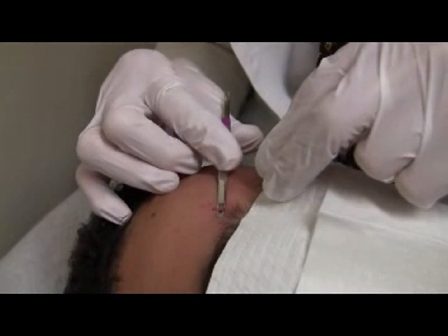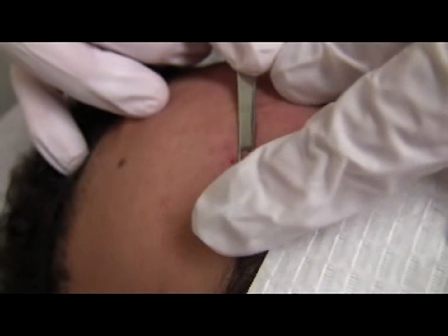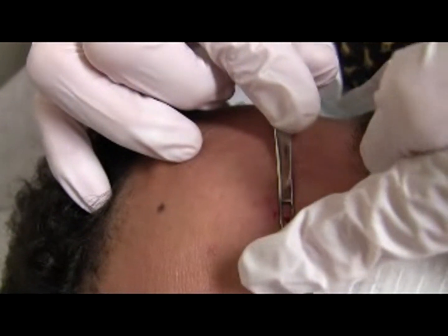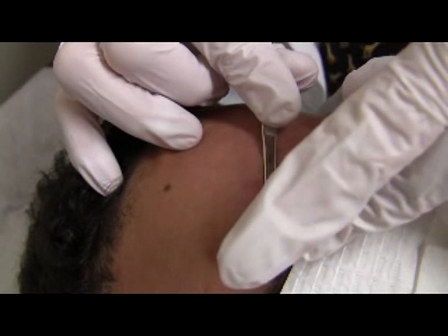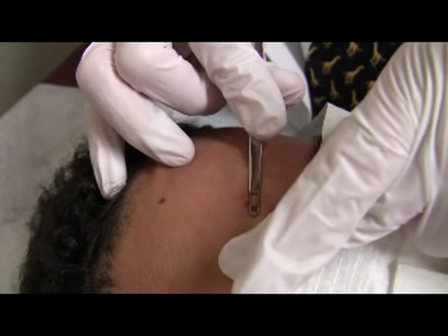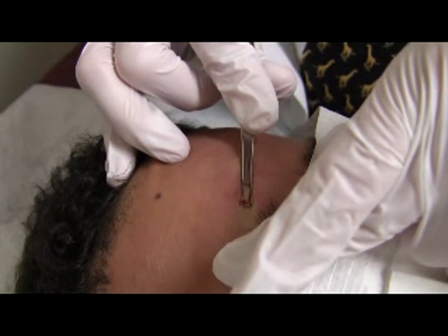While that downward pressure is maintained, pull the loop parallel to the skin. I'm pulling the loop parallel to the skin, stabilizing the skin beyond the loop opposite to the direction I'm pulling. I'm going to pull towards me, and you should see that the comedone should come out.